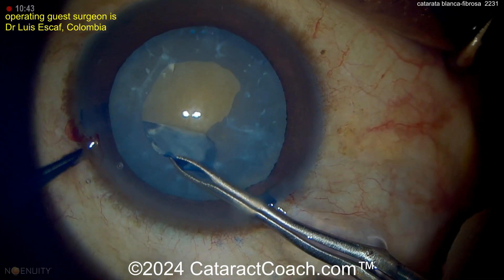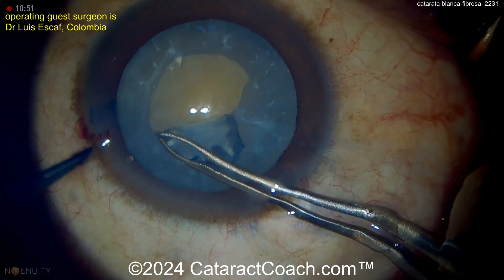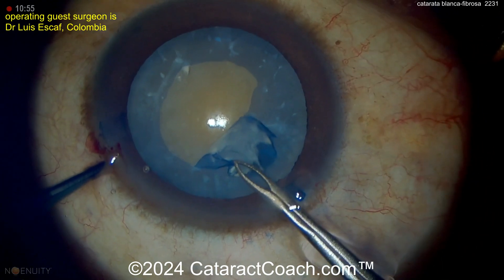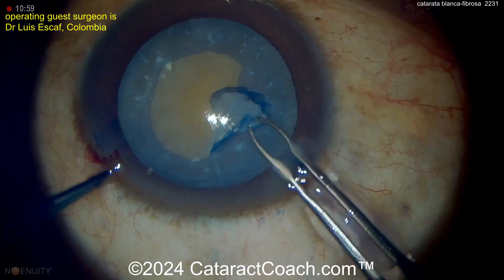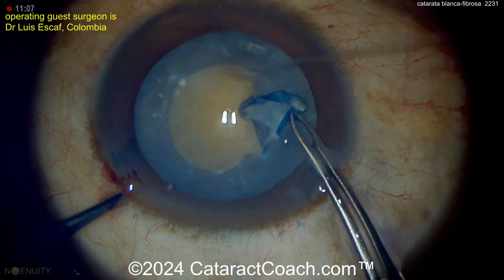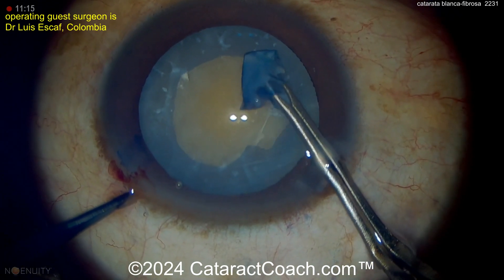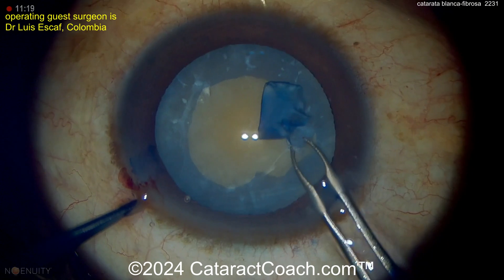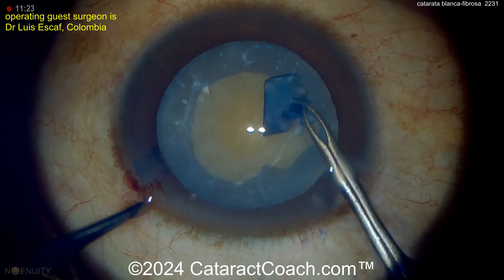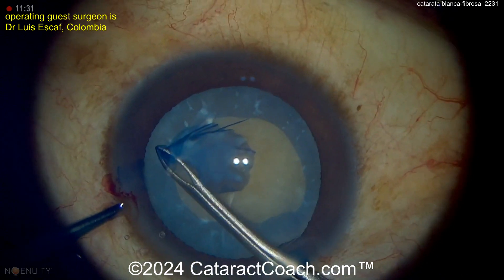Now as you do this rexis, it's a little bit tougher. You can see the capsule is thickened, and there are some adhesion points. So you've got to be very careful in creating this rexis. You can get through these points. Sometimes you can even do some dissection to free the anterior lens capsule from the adhesions. But creating a larger rexis and making it relatively round is probably the best approach here.